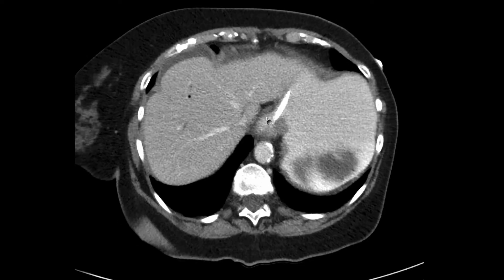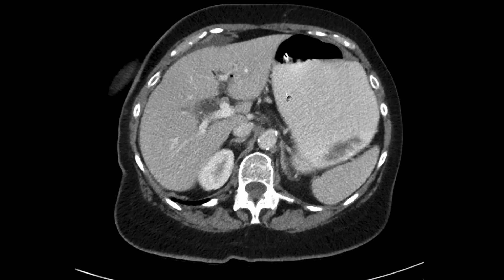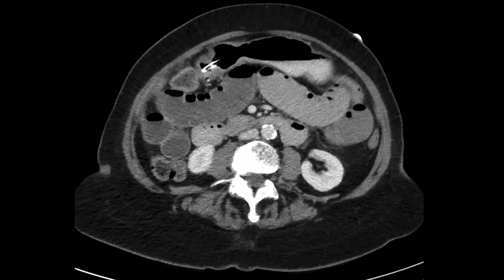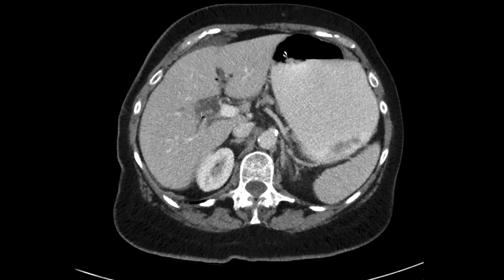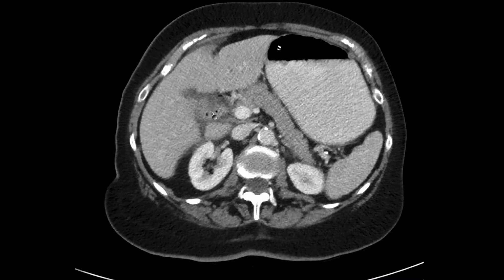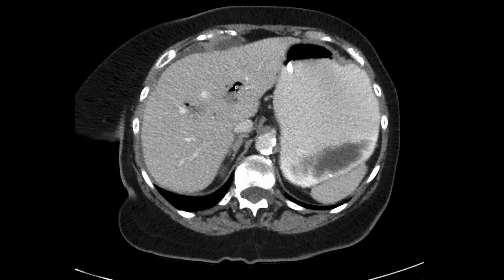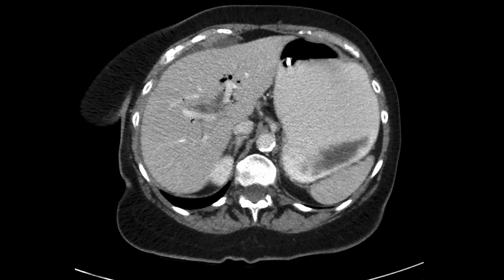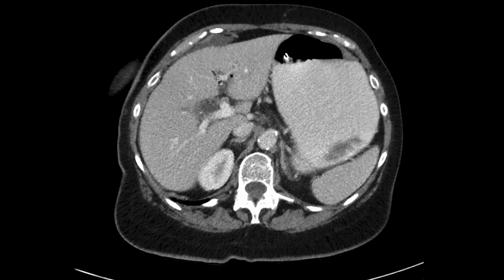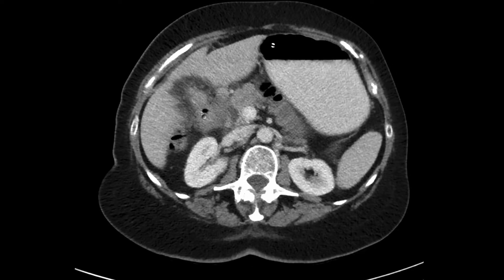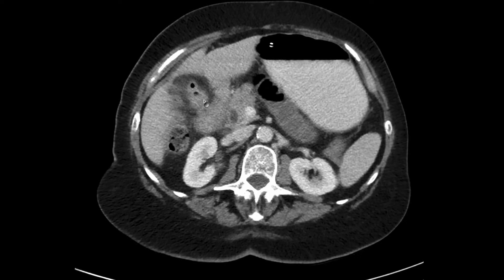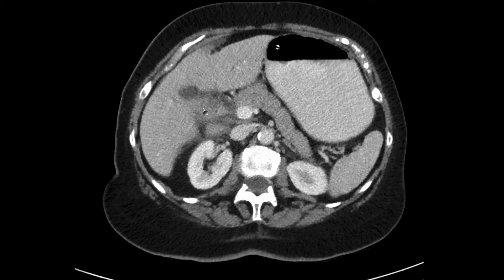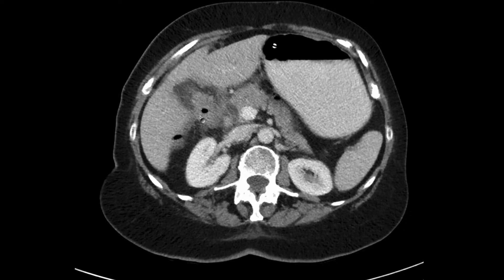This is another patient, an 88-year-old with right upper quadrant pain. We can see the presence of a nasogastric tube in situ, the tip of which is ending in the distal stomach at the pylorus. Looking closely at the gallbladder, it has in fact collapsed, but there are gas locules within the gallbladder and also in the biliary tree. These hypodense structures have the same density as air and are branching and central in position, which indicates pneumobilia. The gallbladder is inseparable from the duodenum, which is suspicious for a fistula between the gallbladder and the duodenum, also known as a cholecystoduodenal fistula.